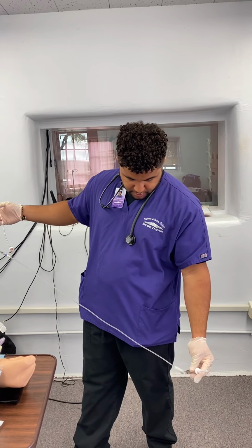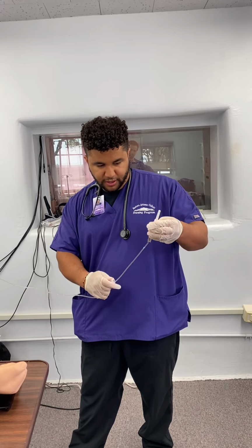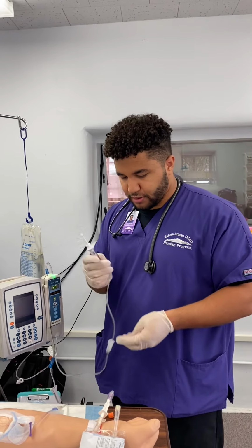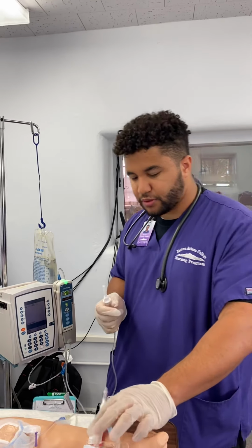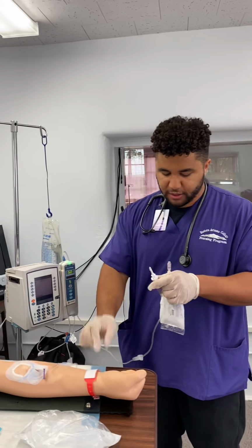It starts to fill up, and you can go ahead and clamp it off once you get about halfway. And now you can go ahead and grab your medicine and spike your bag.